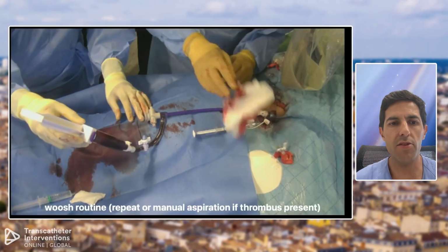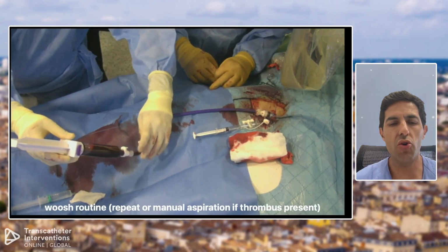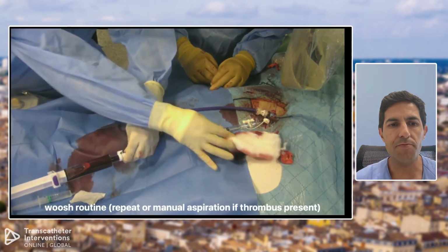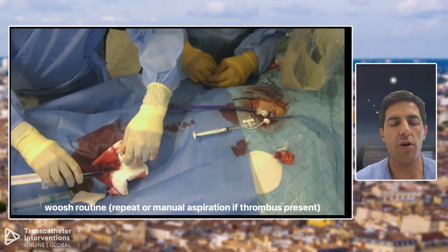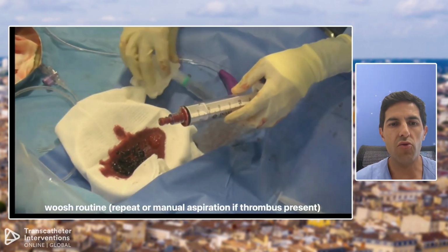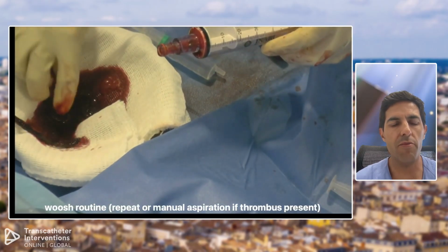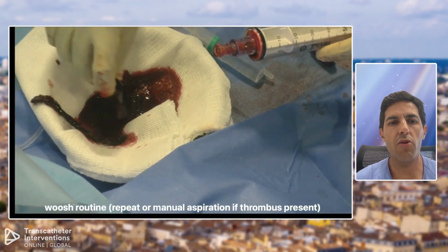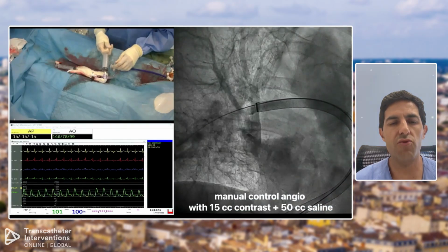I'm taking the dilator out and I'm aspirating. It's very simple. You just pull the syringe, you close, and again, for educational purposes, I'm showing how this was maybe 1-2 years ago. So you just took the content of the syringe, and frequently you will have a lot of thrombi over there, okay? We are no longer doing this. We are filtering the blood and returning the blood, but I think this is very visual.